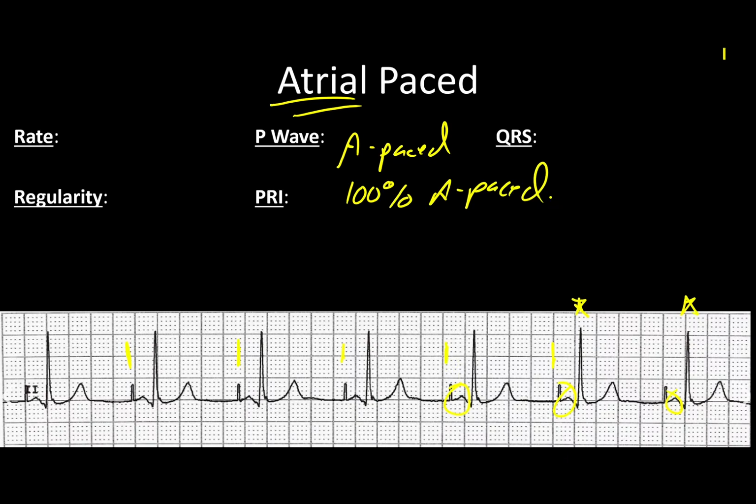It's not terribly complicated to look at. You just ask, do you see the spikes? Is there a response from the heart? In this case, we're looking at P waves. And because the spike is in front of a P wave, that tells you it's atrial. In that previous example, the spike caused a large QRS. That tells you it's ventricular.